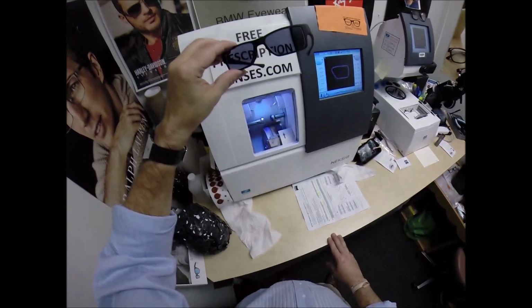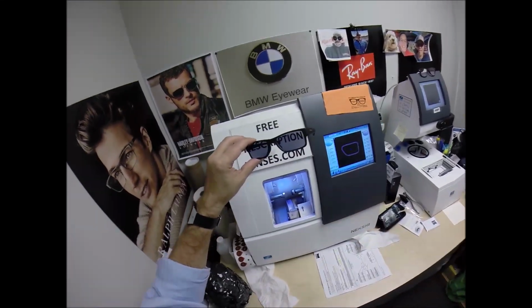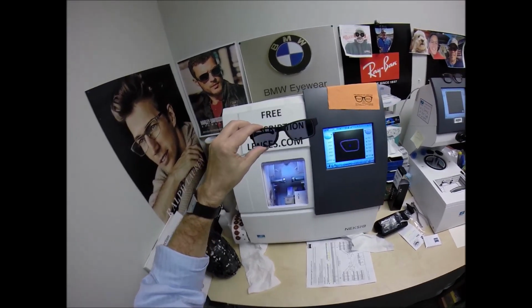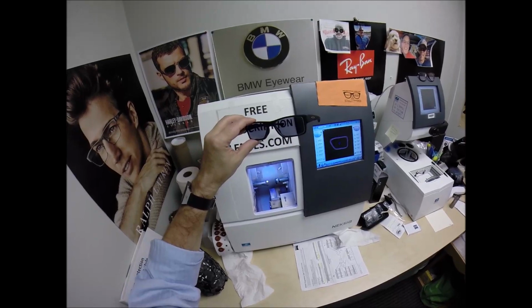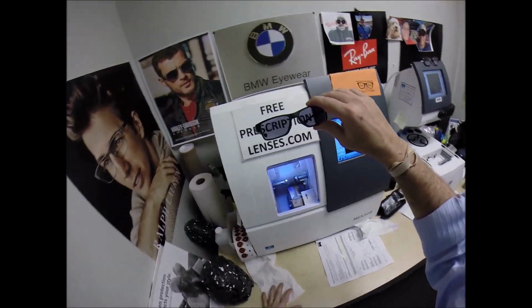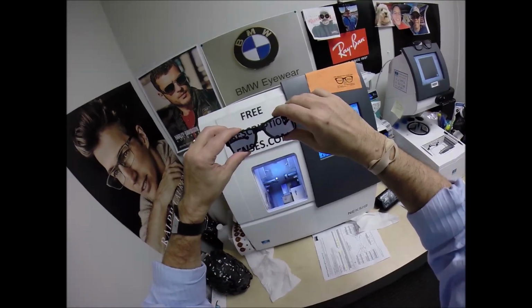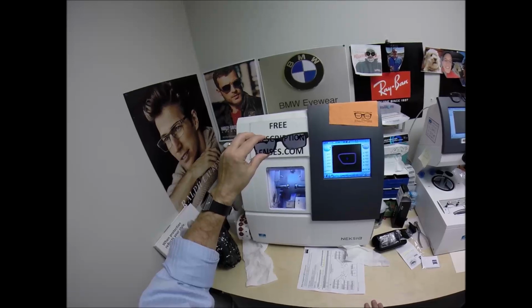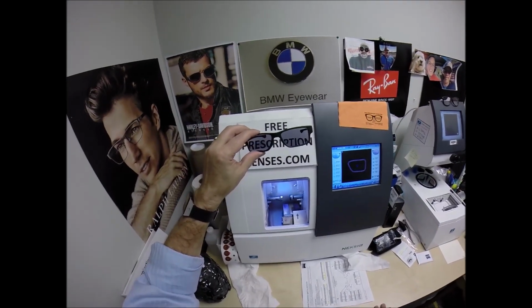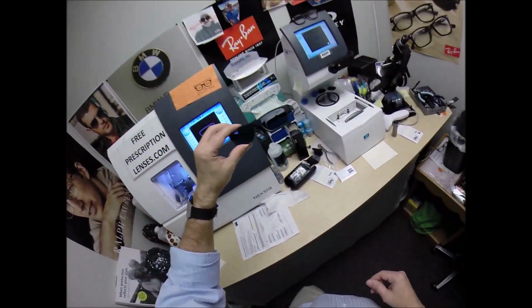Having said that, the Zeiss PhotoFusion Extra Gray and the Essilor Transitions Extra Active will get darker in hotter weather. It's designed for extra active people who spend extra amounts of time outside, hence the name Extra. And as I keep talking, you will see how fast that turns back to virtually clear. Zeiss lenses are clear inside and turn from dark back to clear faster. Essilor's new Transitions Generation 8 claim to turn as fast as the Zeiss lenses, and they're both as good as they're gonna get.